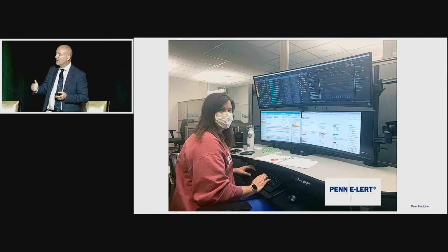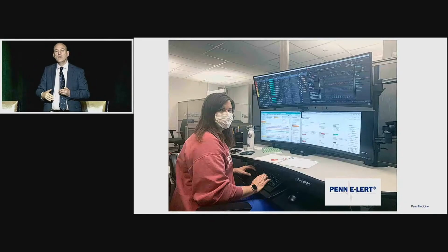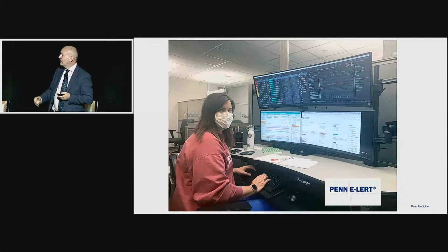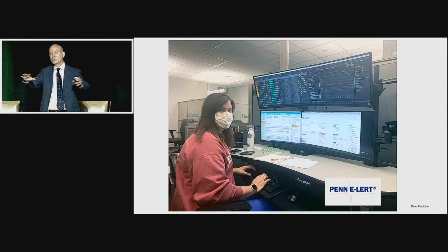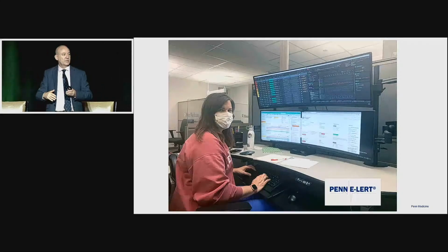So the top left is a list of patients that you'll be looking after. The nurses have more, and then obviously higher risk patients get transferred to an APP or an MD. It's like a watch list with cycling SOFA scores and the best practice alarms. A patient goes to the top left if they fire red. The whole hospital system is live, and every patient that has a BPA that fires red or orange will go to the top of the list and get looked at next.